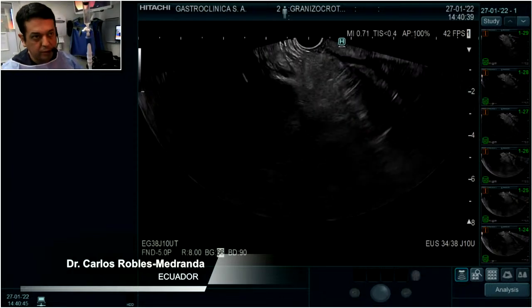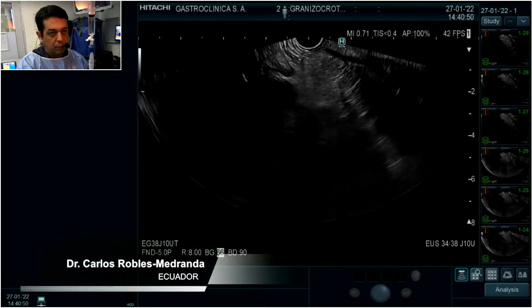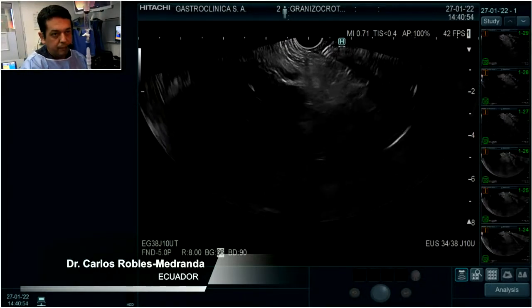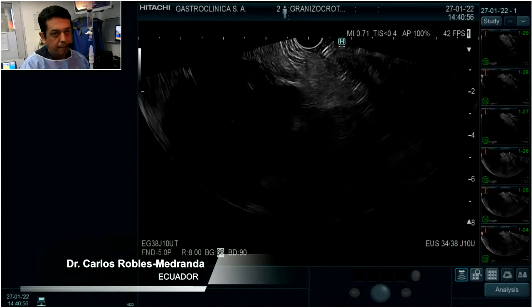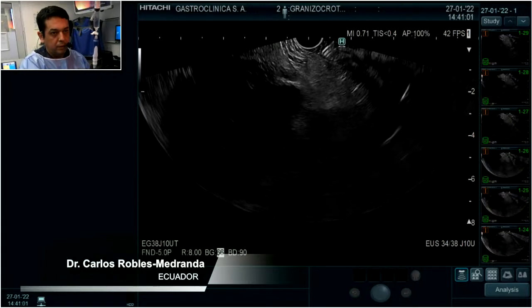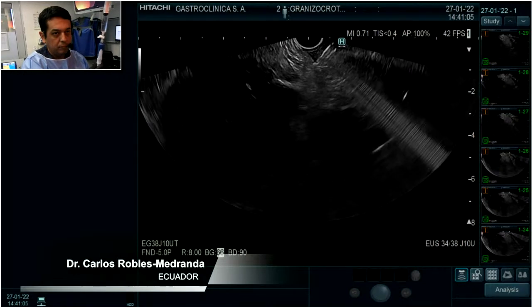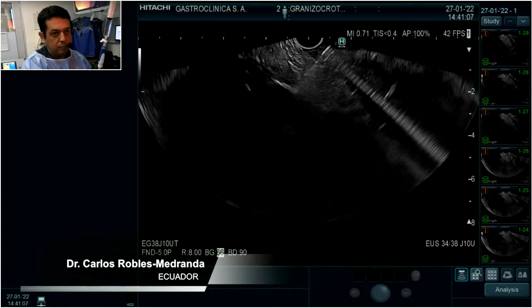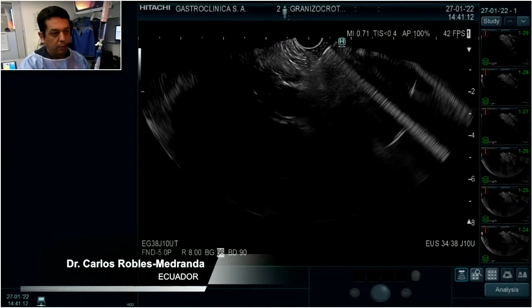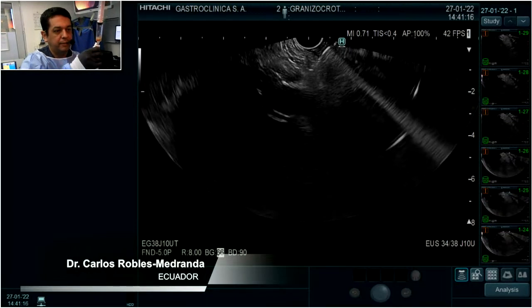Okay, this is good. Now, I will use a 19 gauge needle and I will pass a guide wire. So now you see, I am very well. I do an aspiration and I have this.